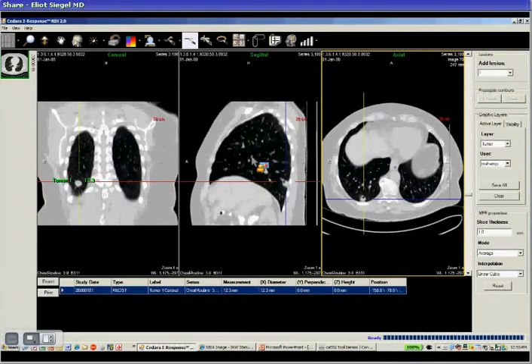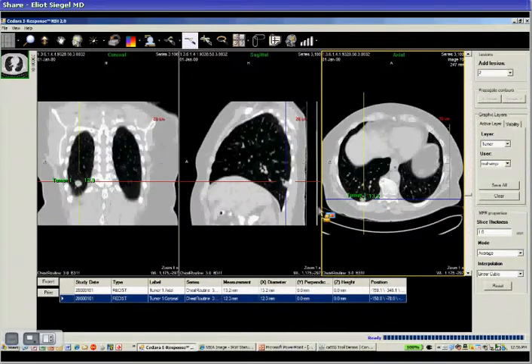and once I do that, the system allows me to go to the workstation that is associated with the NBIA and brings up the imaging studies. And so here what you can see is a CT of the thorax. Here in the axial plane, this is the sagittal, and this is the coronal plane. And I can find a lesion, click on that lesion, and then here you can see the lesion depicted in the right lower lobe. And we can see it on the coronal section, and also see the crosshairs demonstrating it's located posteriorly in the right lower lobe on the sagittal images. You can see there's a necrotic portion of it.